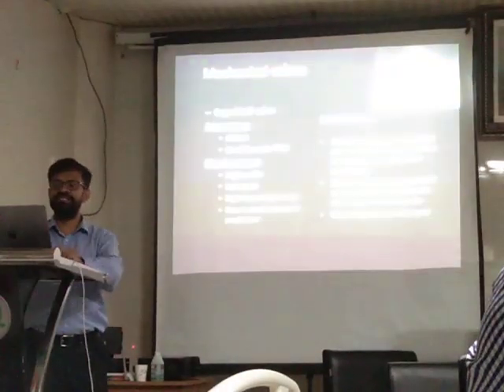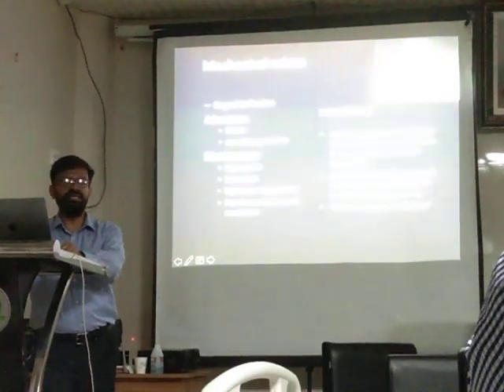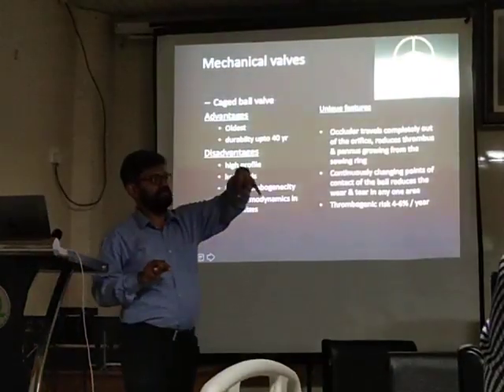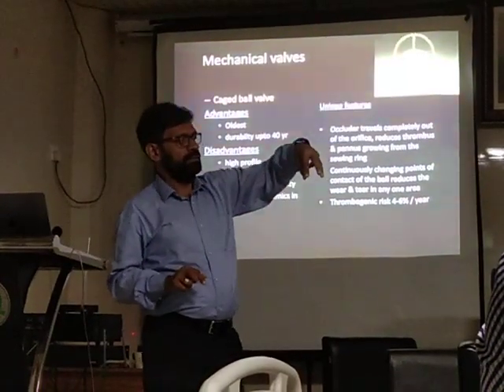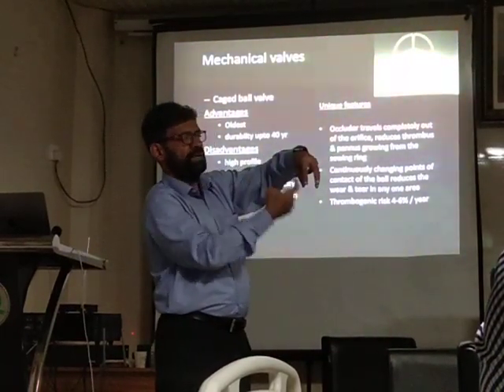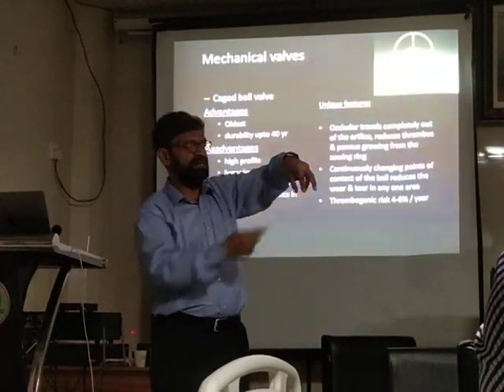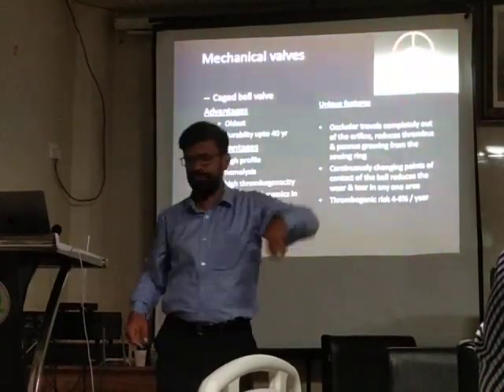So, Starr-Edwards has a ball and cage. So it is like this. Cage, and ball. I will show you. But if you see from 2D, it will show only 2D.